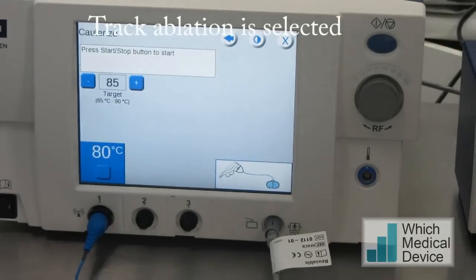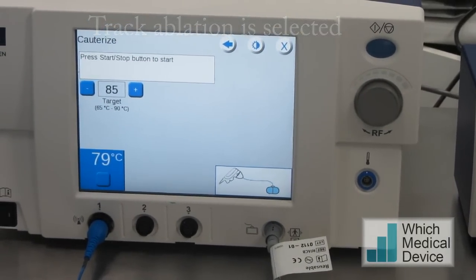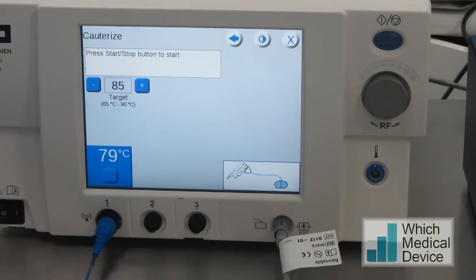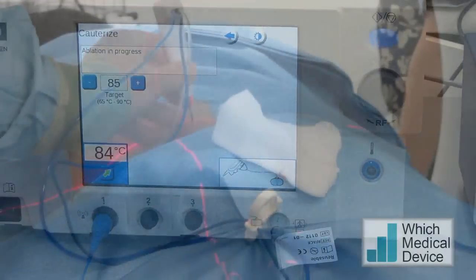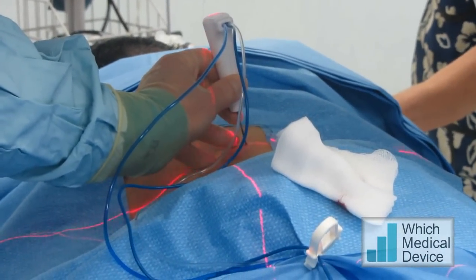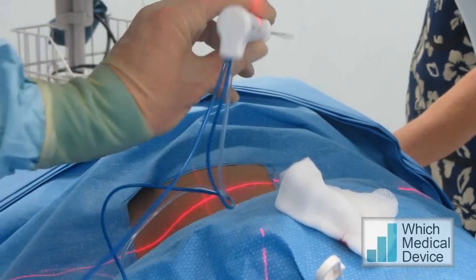We select the electrode again, and it's set to 85 degrees as the target. The machine will adjust the power accordingly as I slowly withdraw the needle. I'm just going to press start and slowly withdraw the needle now. It's quite superficial, so we're just going to stop the ablation there. And that's just finished.